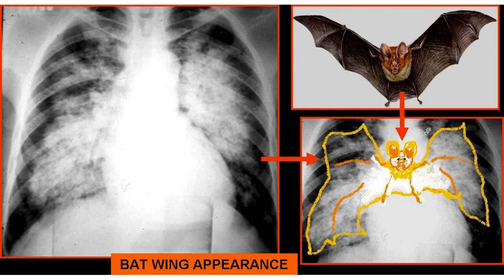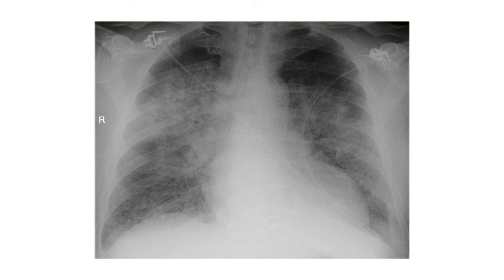You can see why we call it the bat wing sign — it resembles a bat. This is pulmonary edema; it is a frequent disease. If you don't act with accuracy and promptness the patient can die, but if you act very fast the patient can survive easily. This is another chest X-ray showing pulmonary edema and the bat wing sign.